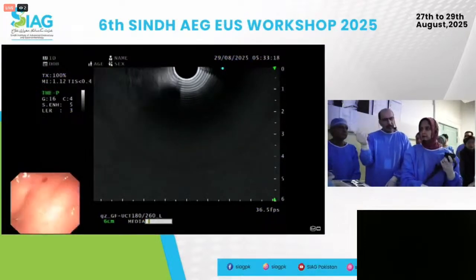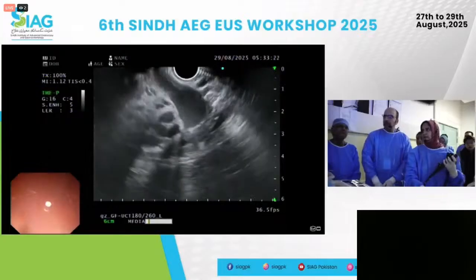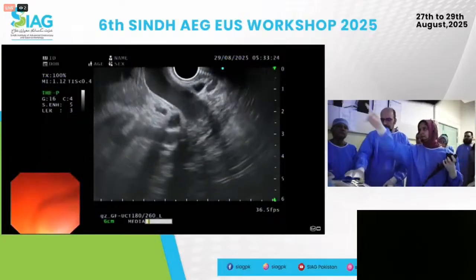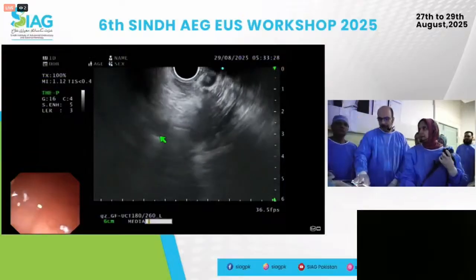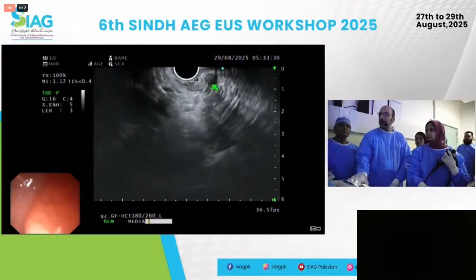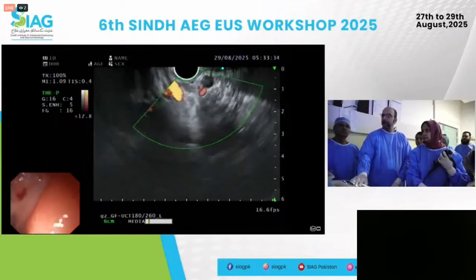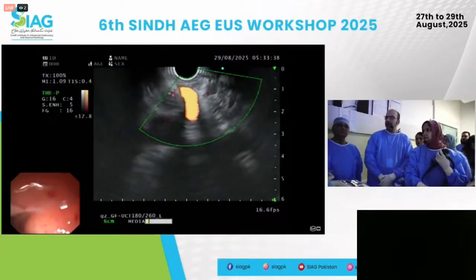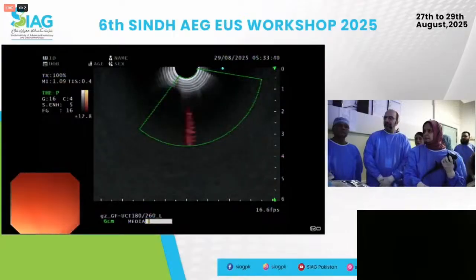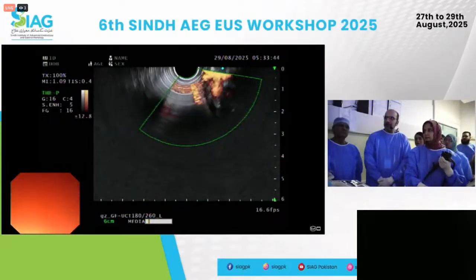In the meantime, you were doing well. You had the duct, right? Yes. So let's get back to that position. So what do we see here? Let me go to the confluence. What is this? It seems like a vessel, but what does Doppler show? I'm trying to release, but when I release it, it just... So you can put your balloon up a tiny bit. That'll help you sometimes in these situations. Just a tiny bit.